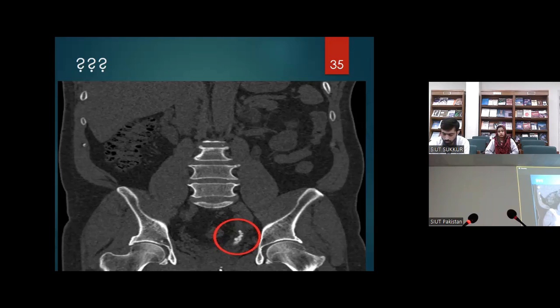There is more chance, as we don't know the density of the stone before the ESWL. For ESWL, the practice is to start from the lowest energy and gradually increase, and observe frequently after 300, 500 shocks. You must check the position, whether the patient is moving or the stone is moving. The stone is viewed at 0 degree and 30 degree. It should be in the target position, right? So always start from lower energy and relieve the pain. This is the practice we usually have.